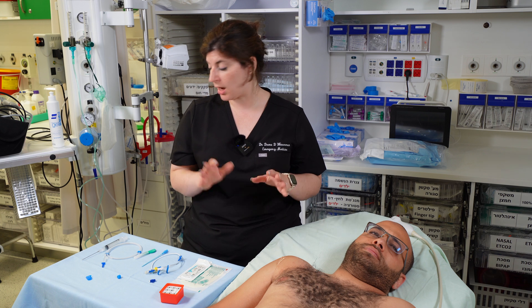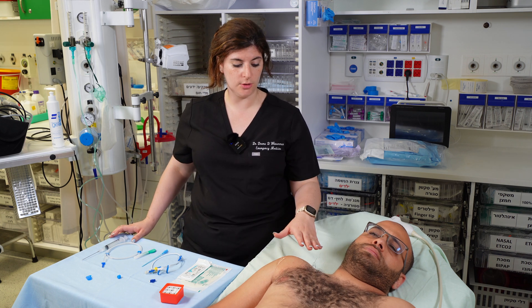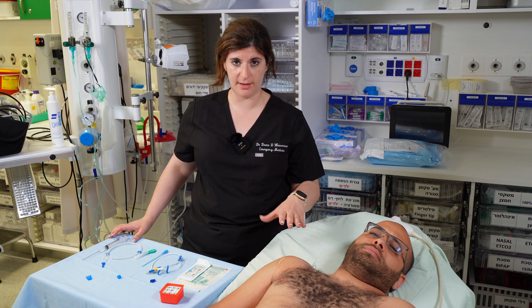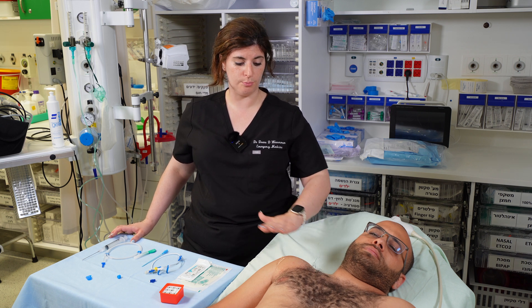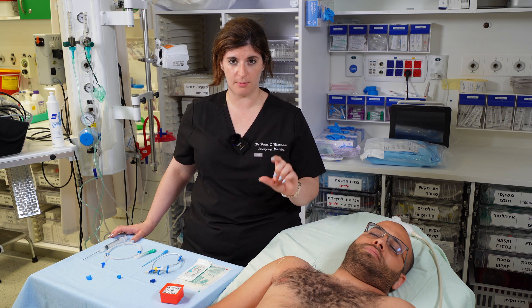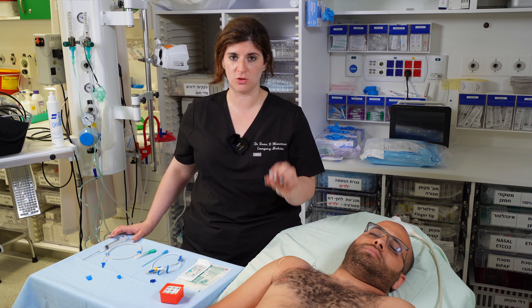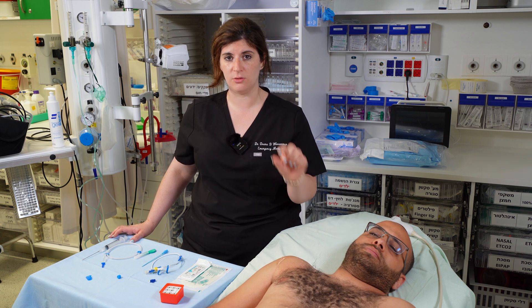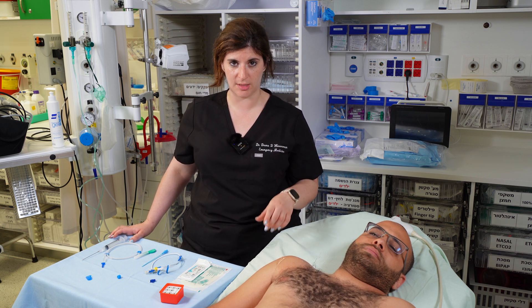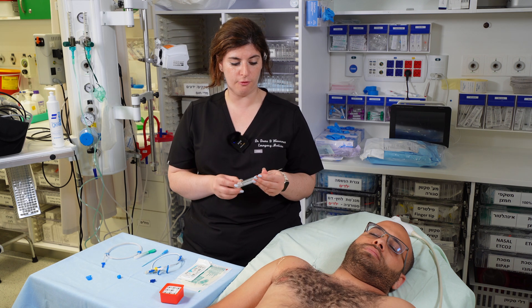A couple of tips: when numbing the patient with lidocaine, do a broad wheal that doesn't distort the anatomy. Use plenty of lidocaine subcutaneously in different patches, but no more than half a cc to a cc in any one particular spot so it doesn't distort the anatomy. Make sure the bevel of your needle is up toward the numbers so you always know where bevel-up is.